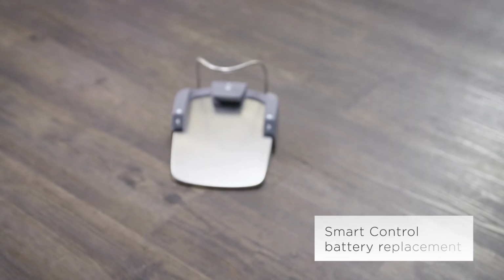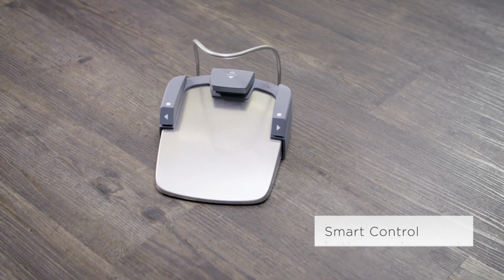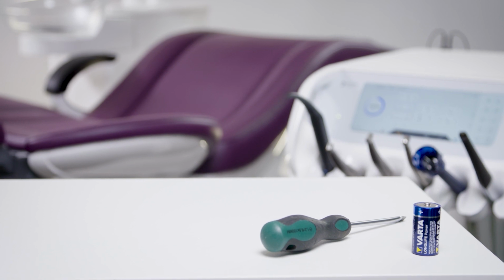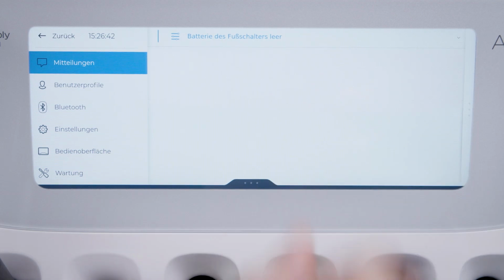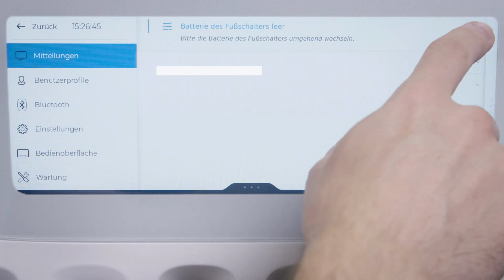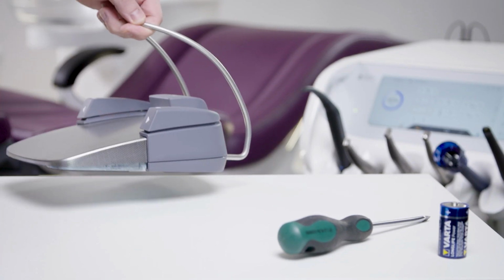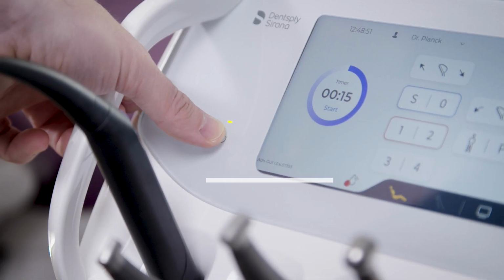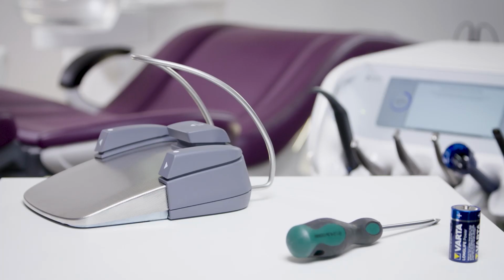In this video, we show you how to replace the battery in the wireless Smart Control foot control. When your Smart Control foot control battery is empty, you will get a message on the Smart Touch operating panel. Switch Axano off at the standby switch before replacing the battery, so you do not inadvertently trigger any functions.